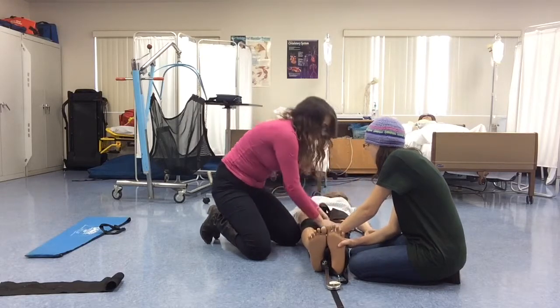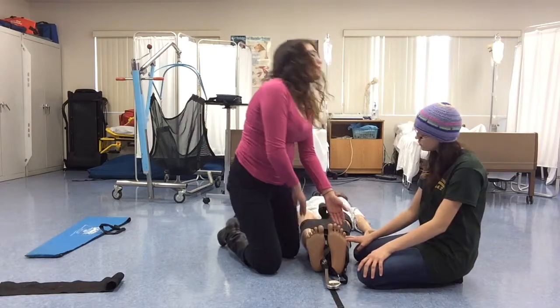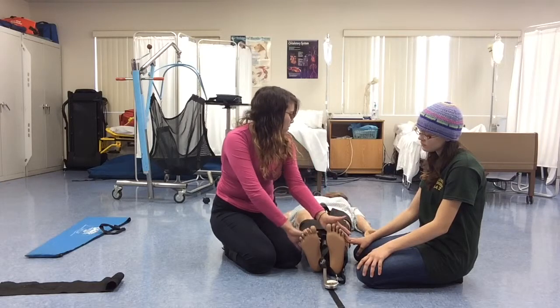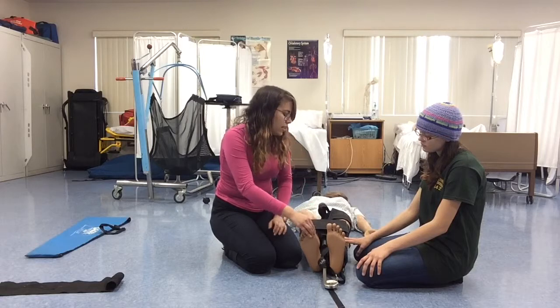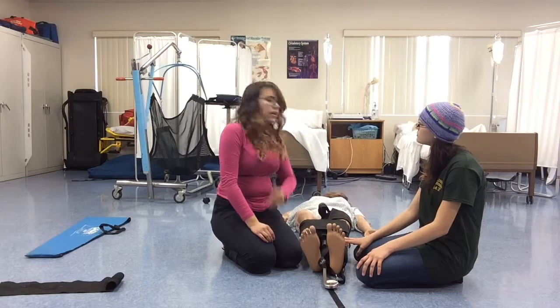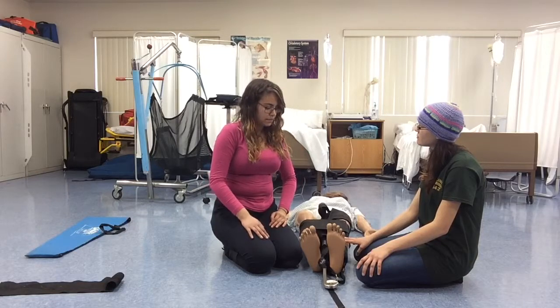Okay. So, and then I'm going to put my patient on the longboard, and then I'm going to check PMSS again. Okay, ma'am. So, checking for pulse. Pulse is good. Push down, push up. Okay, closing your eyes, what toe am I touching? My big one. Closing your eyes, which toe am I touching? The pinky. And then can you move your toes for me? Okay, so all is done. Now we're going to load her into the ambulance and then take her to the hospital.